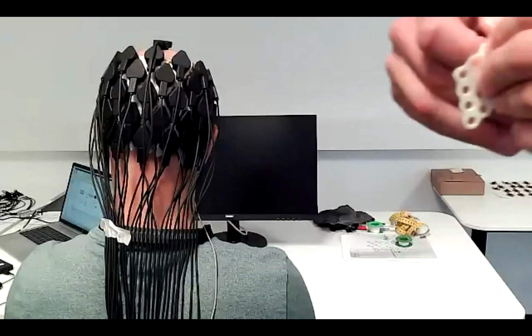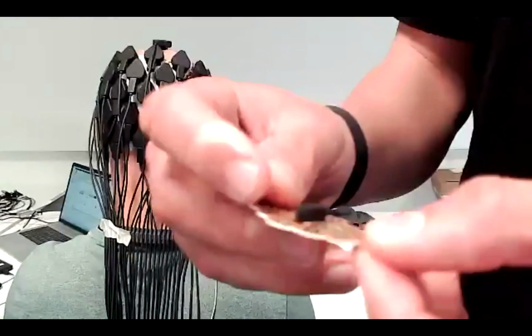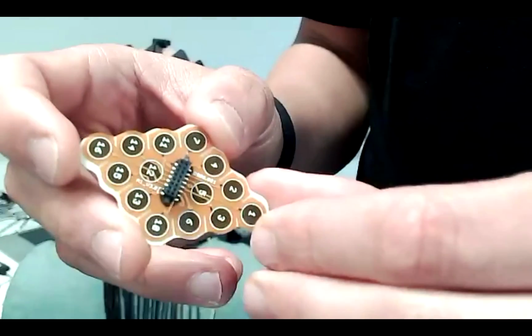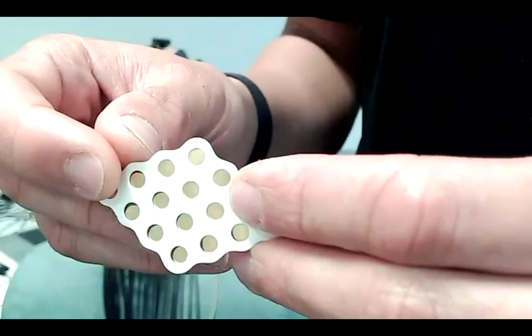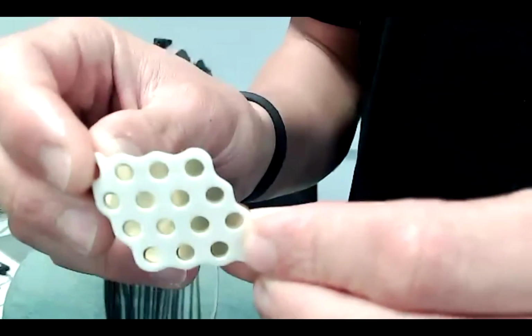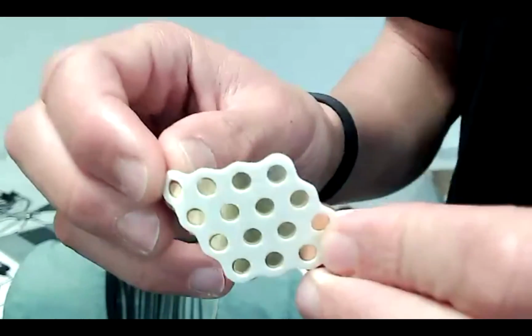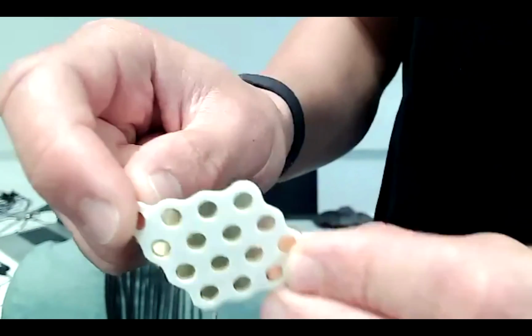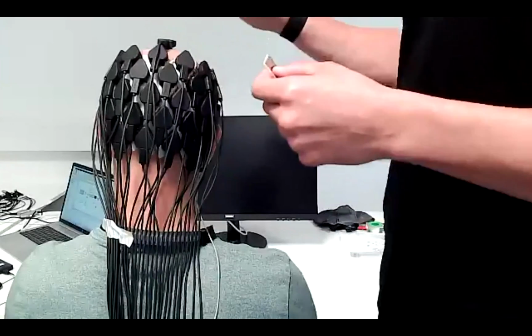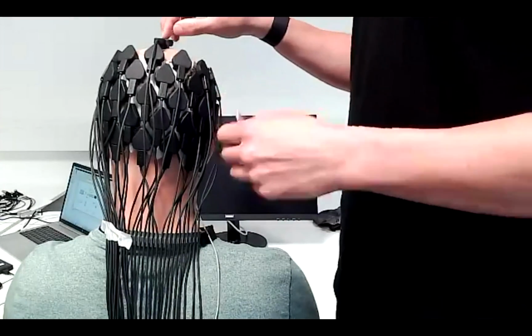So maybe shortly to explain again the system setup a bit of the Pangolin. We have here the electrode grid with 16 channels, and here I attached the adhesive already, and the conductive gel is to be put inside, so we have no shortcuts, and they're insulated. The most important is to prepare the skin, clean it nicely, and then attach the preamplifiers.